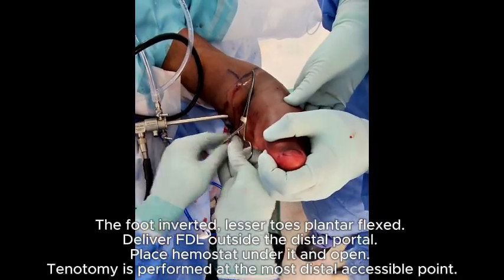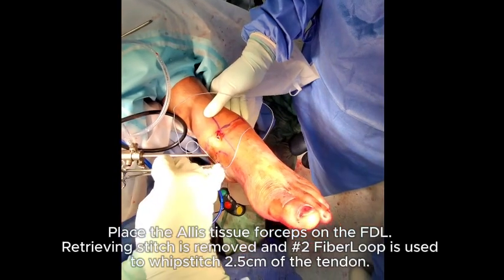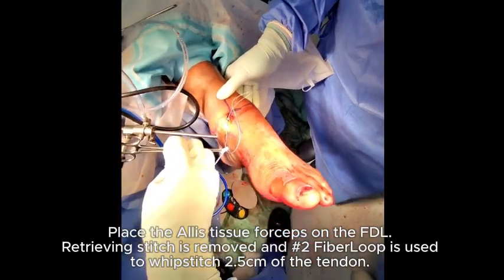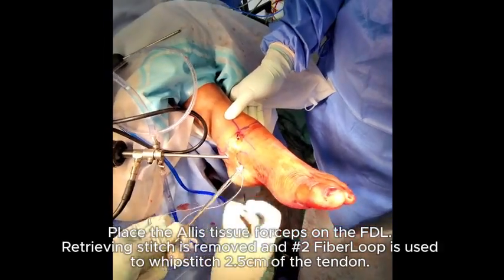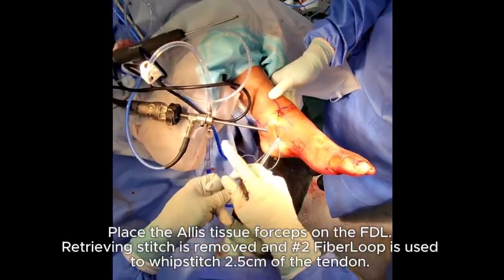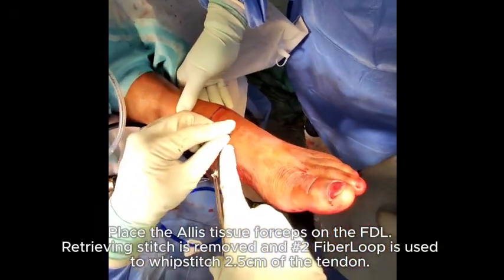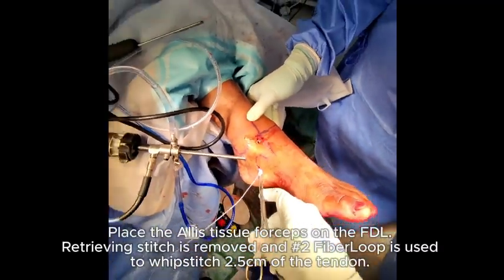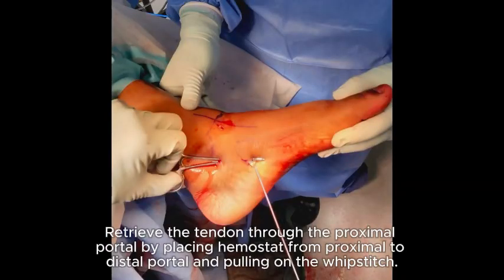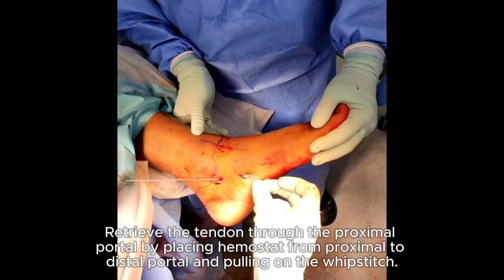The foot is inverted, lesser toes plantar flex, deliver FDL outside the distal portal, place hemostat under it and open. Tenotomy is performed at the most distal accessible point. Place the Allis tissue forceps on the FDL, retrieving stitch is removed, and number 2 fiber loop is used to whip stitch 2.5 cm of the tendon. Retrieve the tendon through the proximal portal by placing hemostat from proximal to distal portal and pulling on the whip stitch.